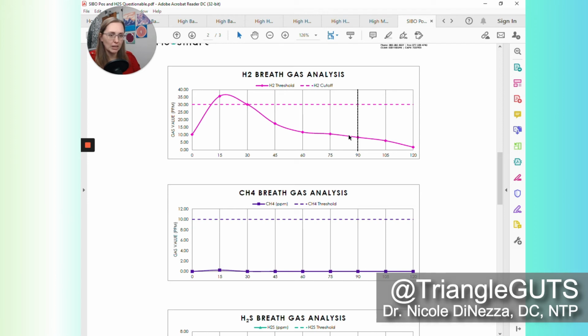This is a very classic case of SIBO, and this is a case where probably the SIBO is very high up. Like I'm talking duodenum or maybe the upper part of the jejunum. This is right up high in the system, and it's probably pretty severe. Now, there is something to be said for the severity of symptoms correlating with the severity of methane overgrowth. Like the more methane you have, the more constipated you will be. This, I'm saying, is probably severe not because of the quantity of hydrogen, but because it's right there just on the other side of the stomach, and then it peters out.